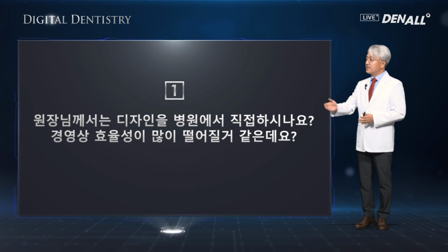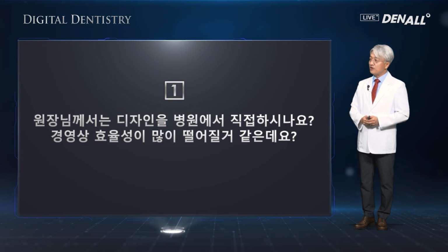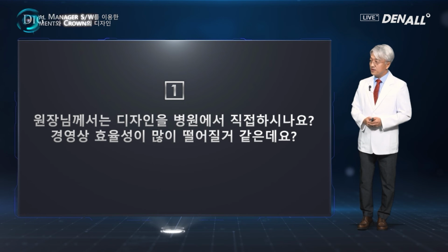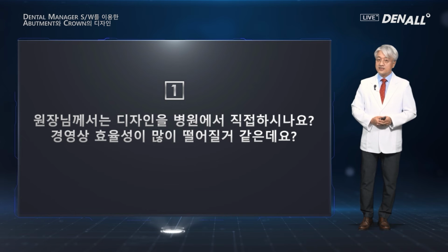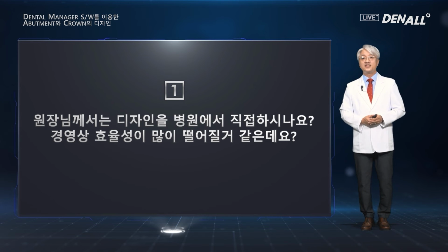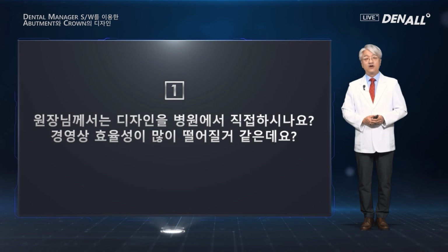The first question, do you do the designing in your clinic yourself? If so, your management efficiency may decrease quite a lot. Very good question. This is something I thought about a lot before. At the beginning, I did the designing myself in my clinic.